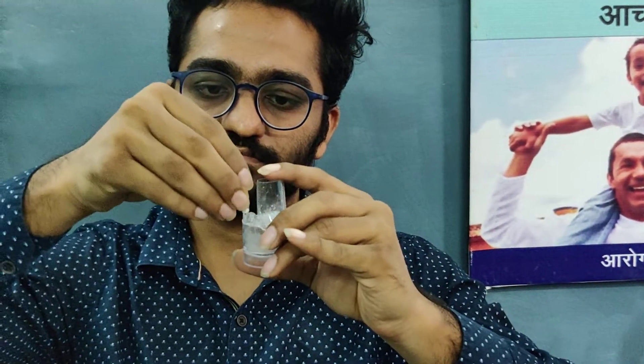Step 4: Dry Powder Inhaler. In the right hand there is a rota capsule and in the left hand there is a rota inhaler. Now put the capsule transparent side into the rota inhaler.